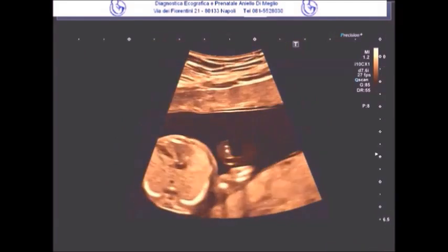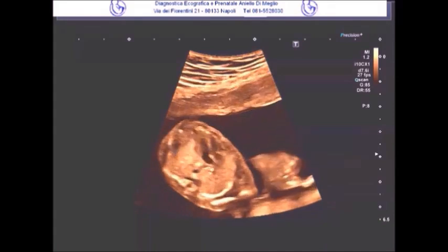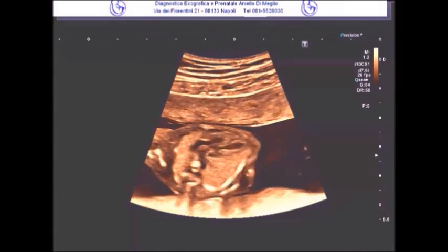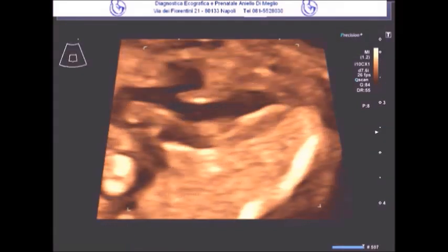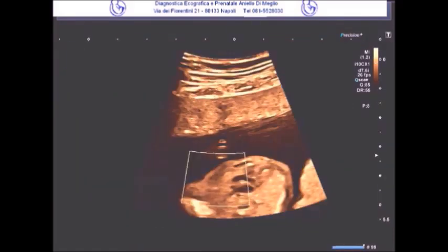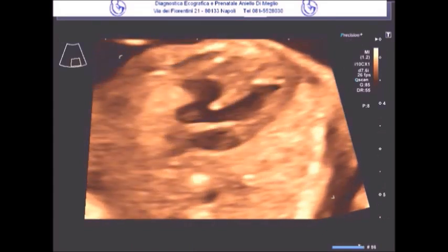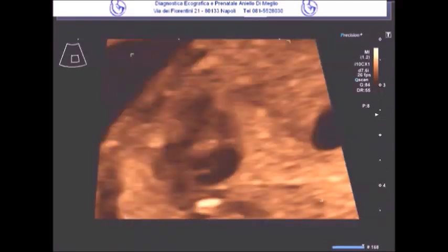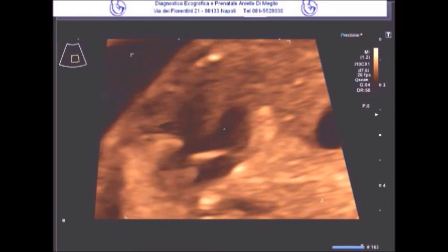Now, let's carefully observe the left section here, which in the transverse view appears to be quite normal. However, let's now study it in another detailed scan, where the presence of a specific finding is much clearer. Here we have a clear view of an aorta that we define as overriding, specifically because it arises by straddling the ventricular septal defect, which we are now also going to measure quite carefully. And in this specific case, the measurement comes out to be approximately 2 millimeters.